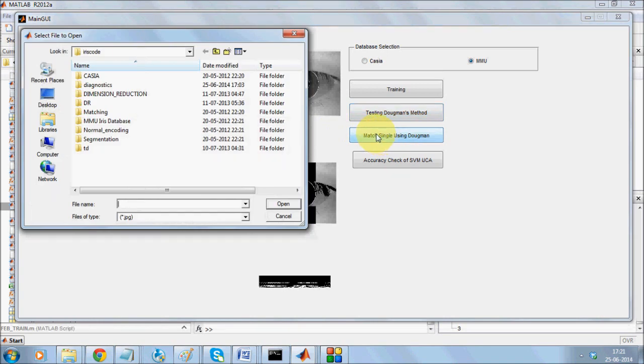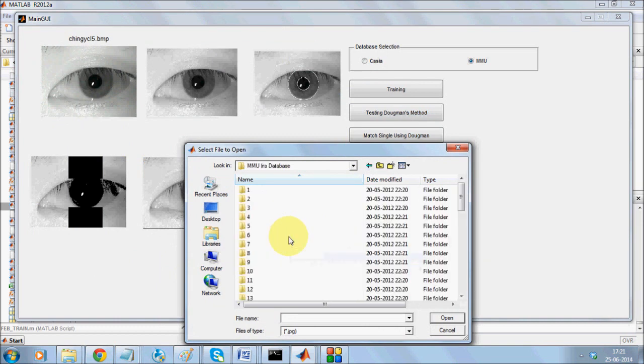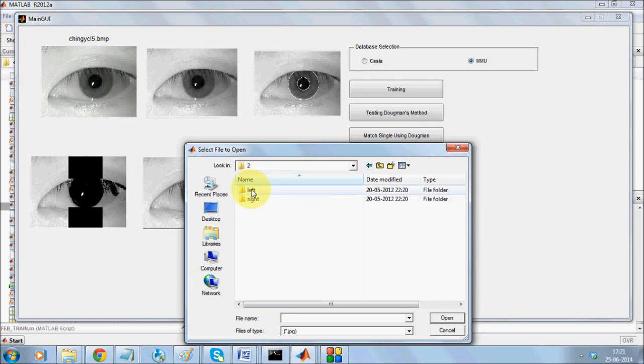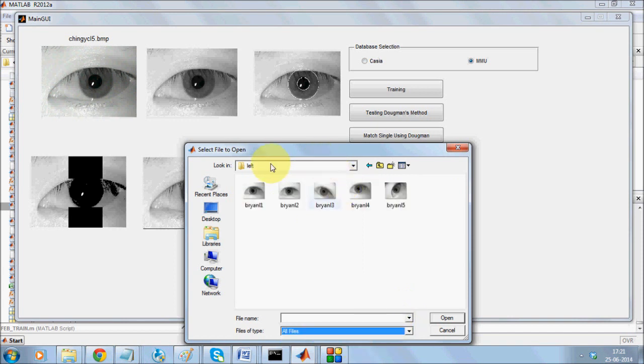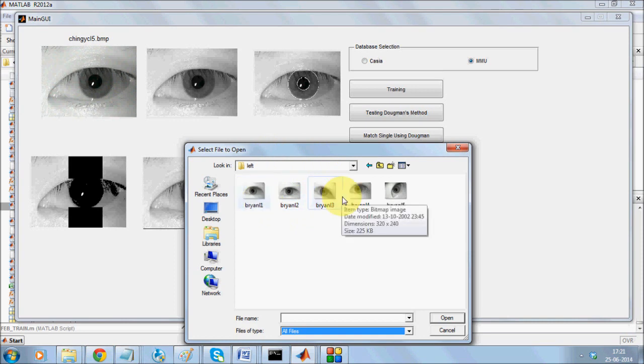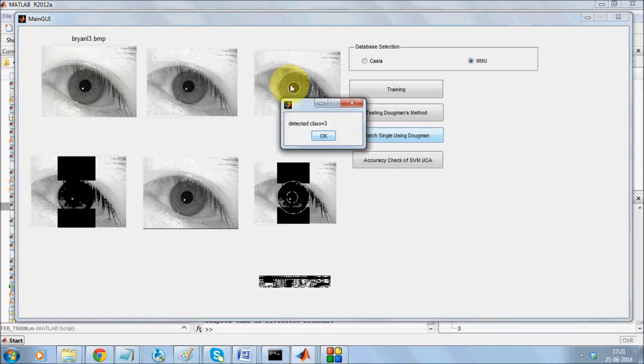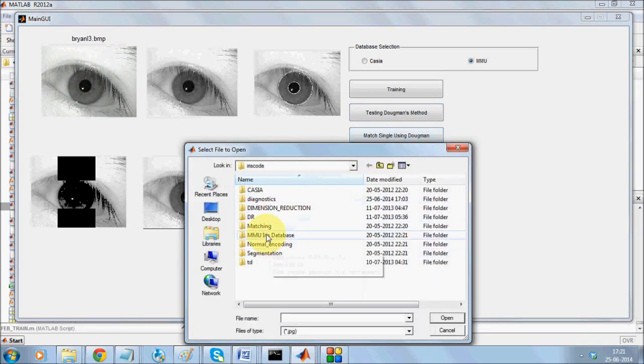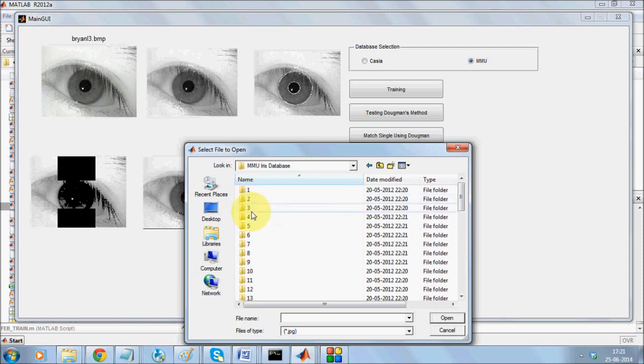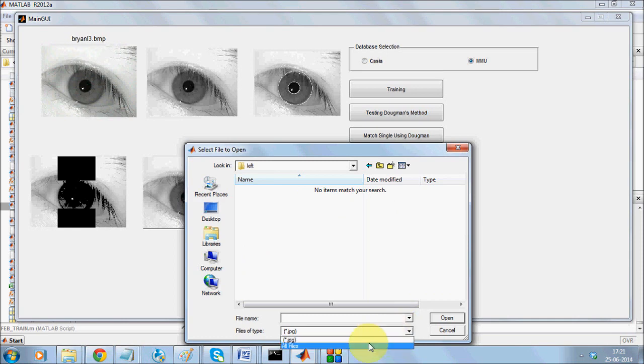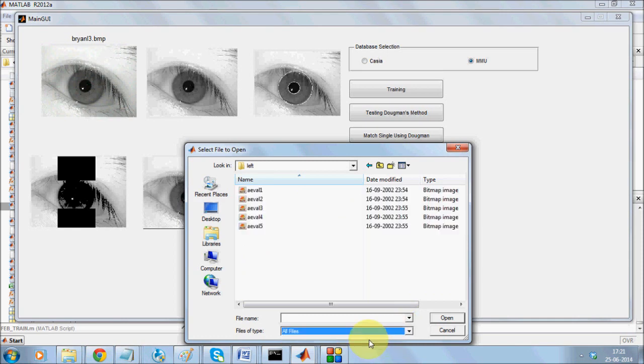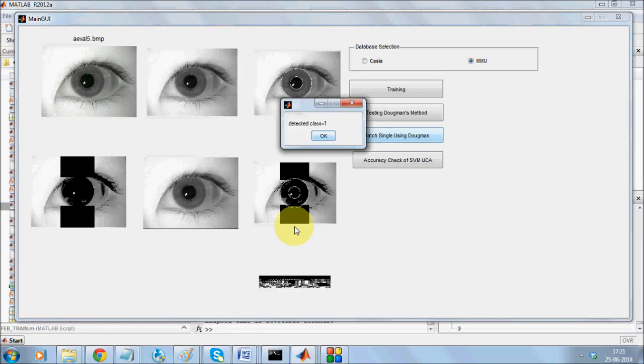Now I am going to show you how the single iris is detected. Basically I am using the MMU iris database. I am going to use a particular person's left eye. Say I am using person number 2's left eye. I am going to select one specific image, say for instance the fifth image. So the detection is correct.